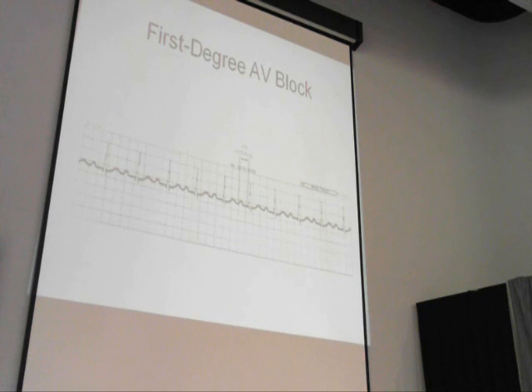Very seldom does this get worse, get deadly, and go to higher levels. But that's not to say that you ignore this if you notice it on the monitor. If my patient had been in a normal sinus rhythm yesterday when I worked, and I come in today and run my strips at the very start of the shift and see this, what two things do I want to check real quick? Labs and medications, and have they been getting the medications correctly?